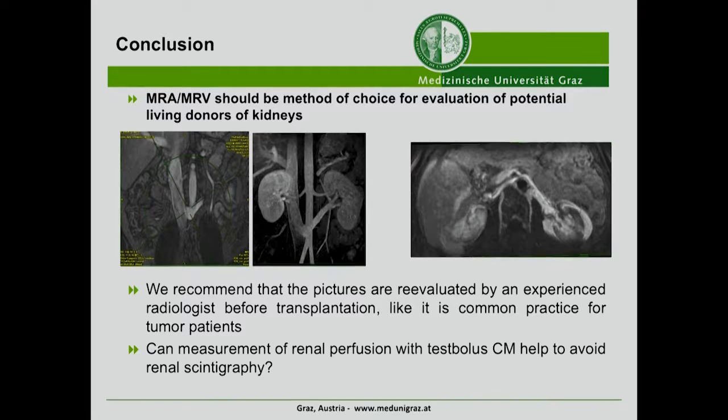And the question is, can measurement of renal perfusion with test bolus help to avoid renal scintigraphy, like Giles reported to us yesterday, very inspiring results.